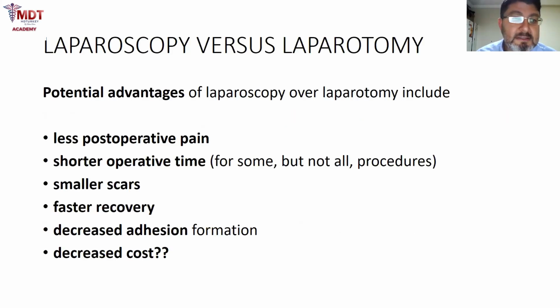It has many advantages compared to laparotomy: the patient will have less postoperative pain, the surgery will last shorter, the patient will have smaller scars and will recover faster. And of course, another advantage is decreased adhesion.